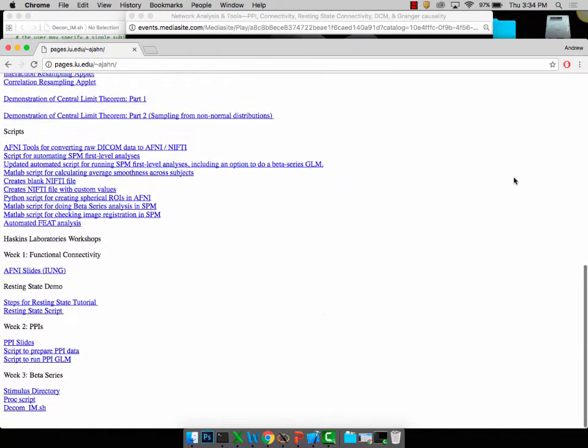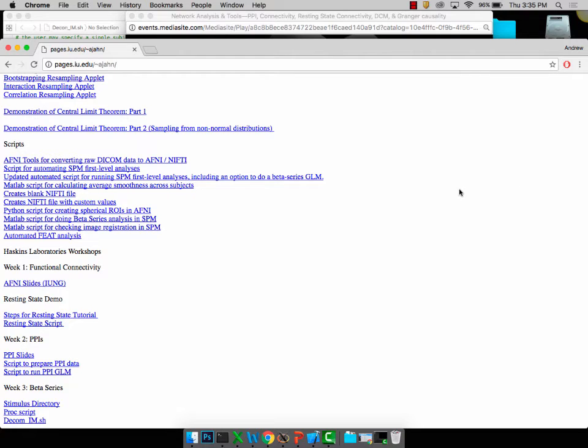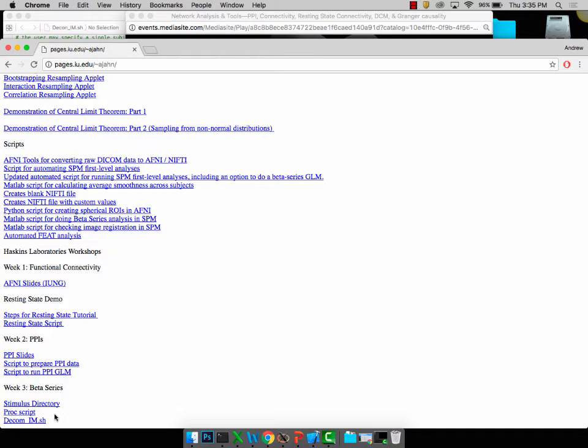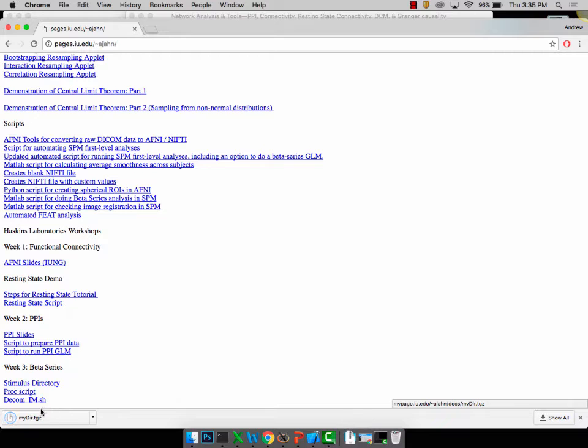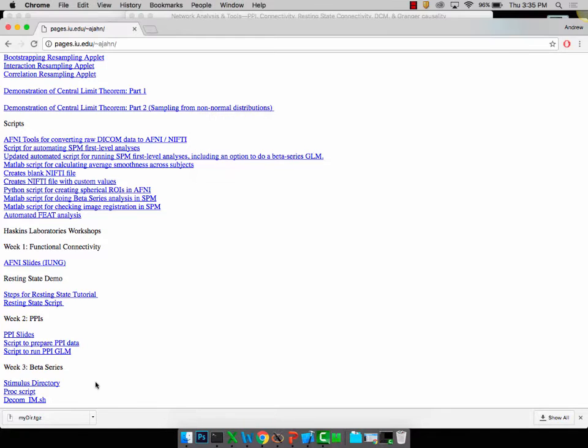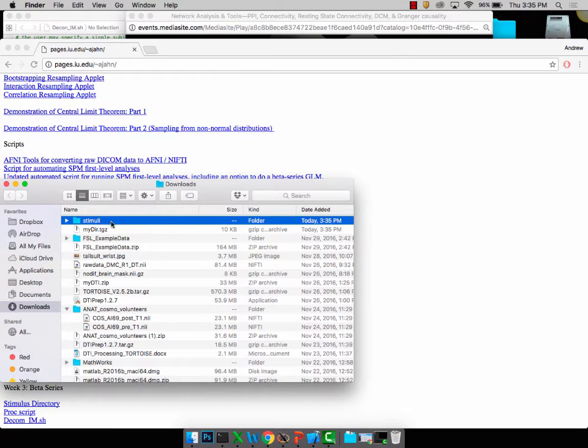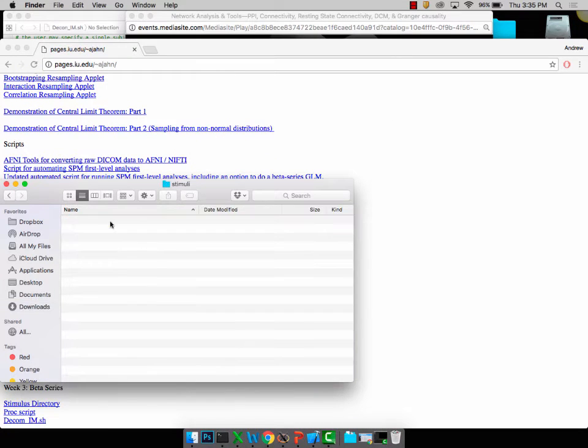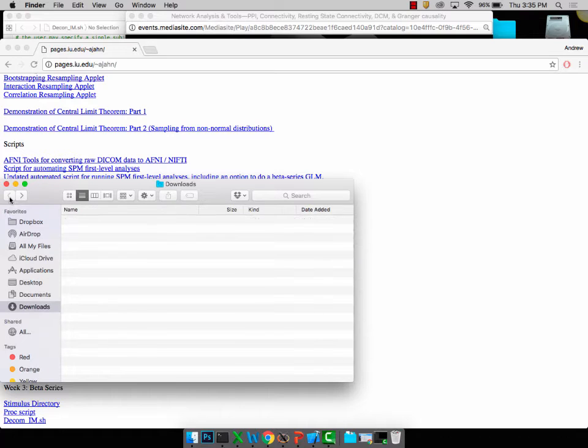At the very bottom it says week three. Download all those links: stimulus directory, proc script, and dcom underscore im.sh. Actually we probably won't use the proc script. But download stimulus directory and dcom im. If you download stimulus directory, it's mydir.tgz, you can unzip that and it'll give you this folder called stimuli. This has all the different timing files we'll be using for this demonstration.